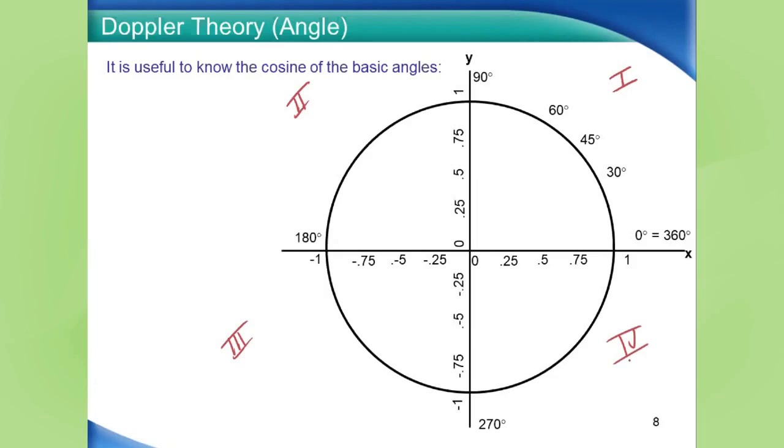And I have them labeled here. So clearly 0 degrees is easy to visualize, and 90. Well, 45 is also very easy because it's exactly halfway between 0 and 90 degrees. And what else is easy to visualize? Well, 30 and 60, because it breaks the circle down into a third, a third, a third. So we have our basic angles of 0, 30, 45, 60, and 90 degrees.